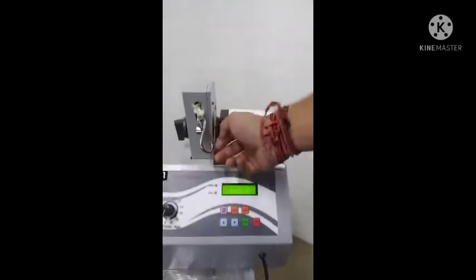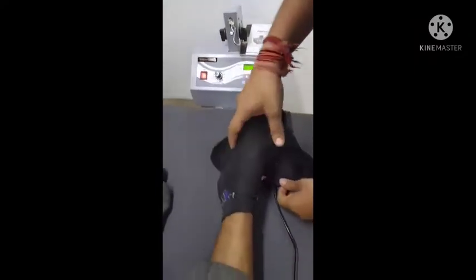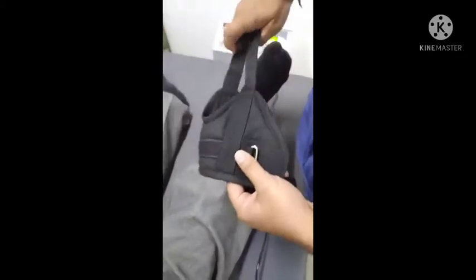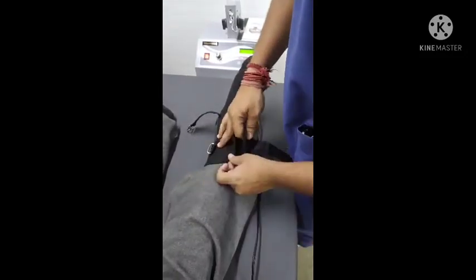Okay, now we release the knob so the traction cord can move. Firstly, we tie the ankle belt on the patient's affected leg. So this is an ankle belt. We have to place it at the patient's ankle.